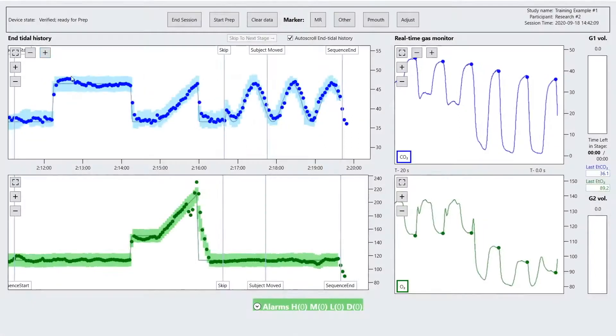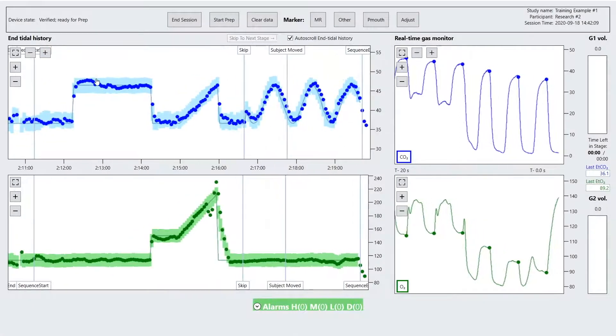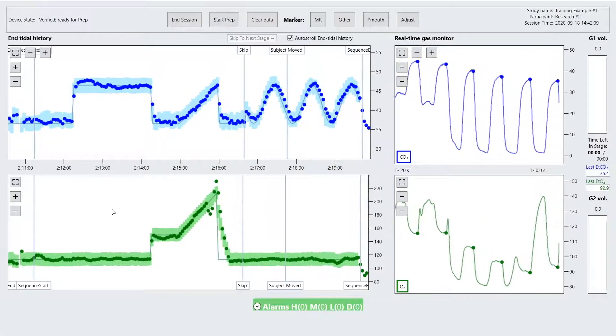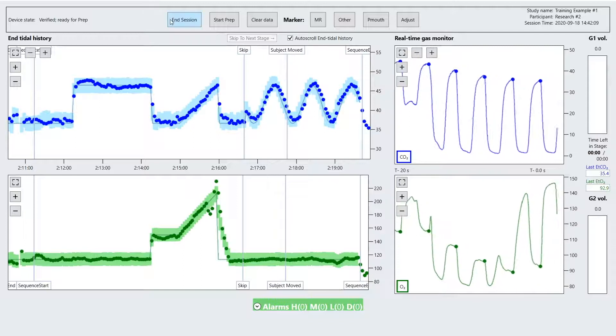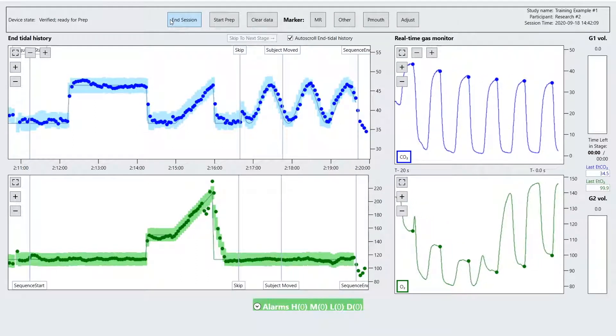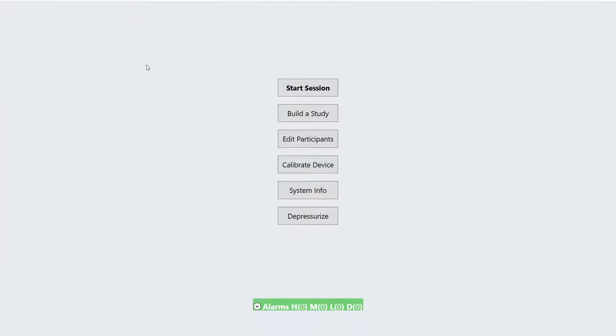When you have finished your study, press the end session button to exit to the main screen. Log files from your session are saved in the following directory.